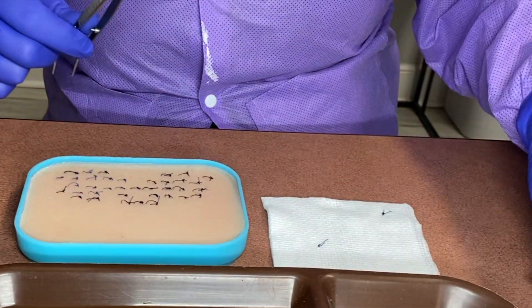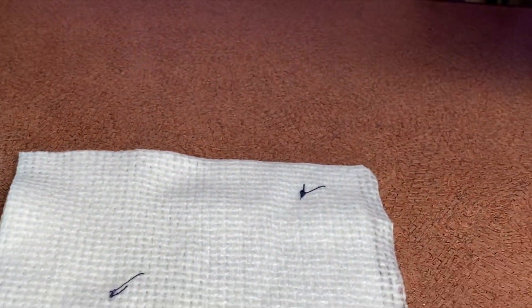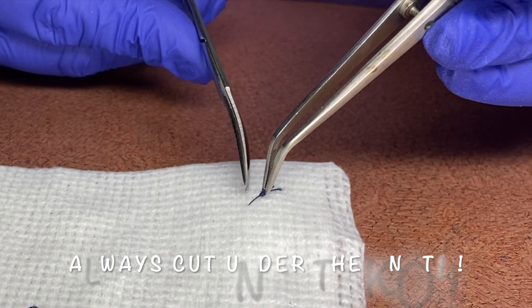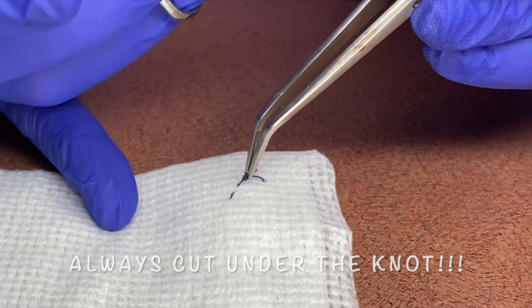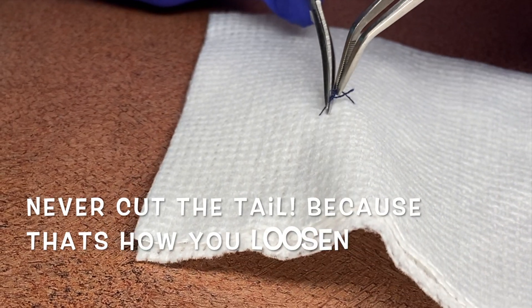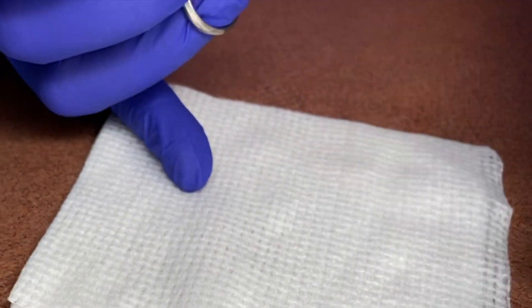Going ahead and removing our sutures — we'll do it on the cotton first. We will just grab our knot and then cut right beside it and pull it off. We'll just grab our little knot — the suture is loose on the tissue — and pull that off.